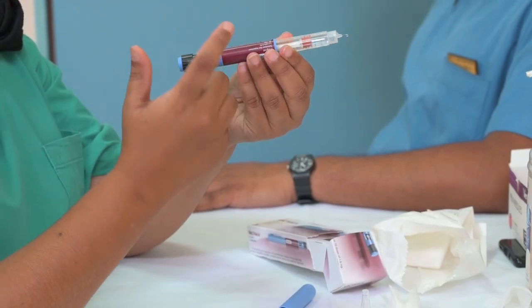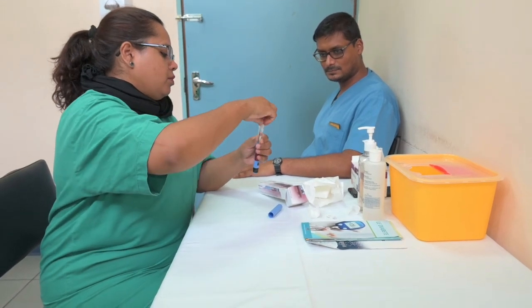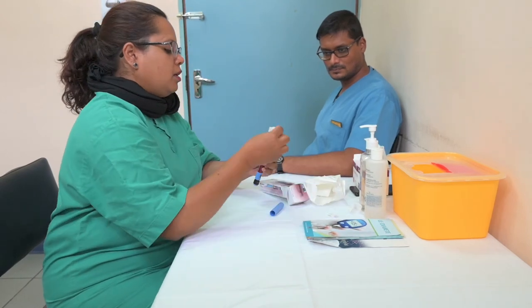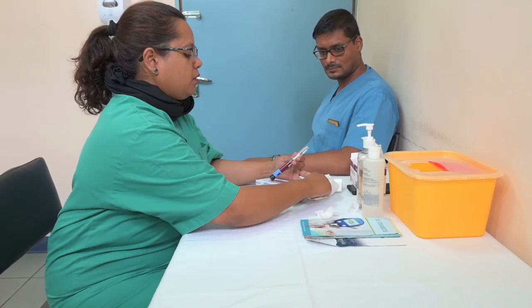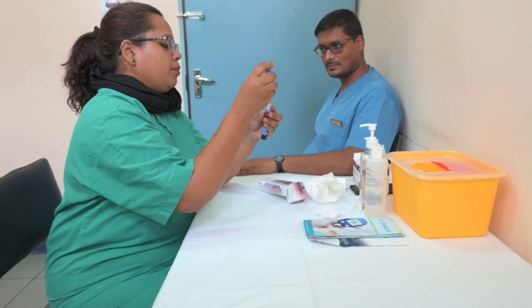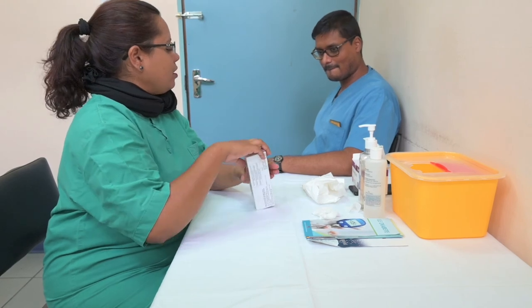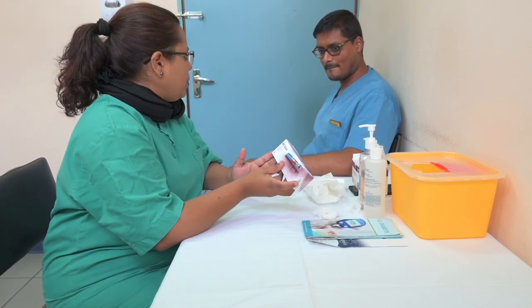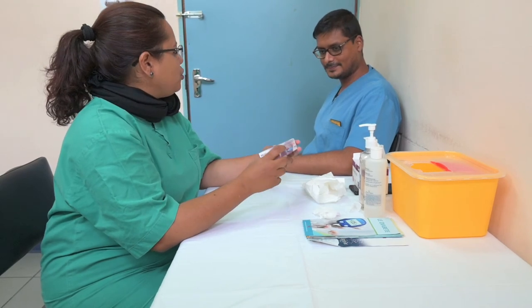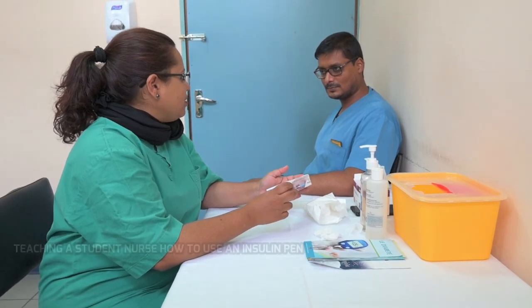When you are finished, then you just cap it again with the big cap, turn it, remove the needle, discard it, clean, then I also swab again. Okay, cap it and store it. Now you store it in a cool, dry place, not in the refrigerator. Okay, you'll be able to show it to me how to do it, or you'll be able to use it at whatever. Yeah, sure. Okay.